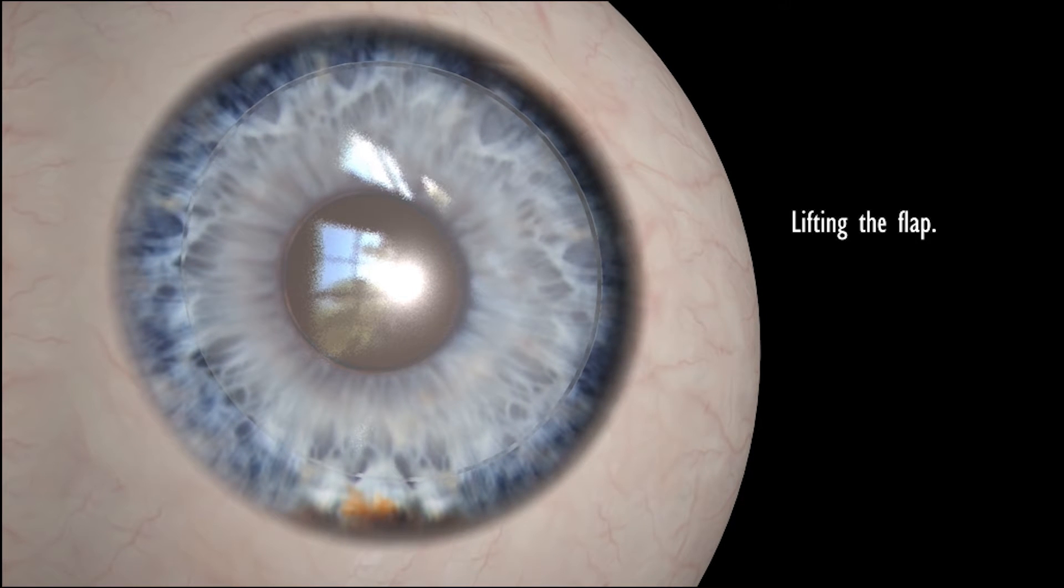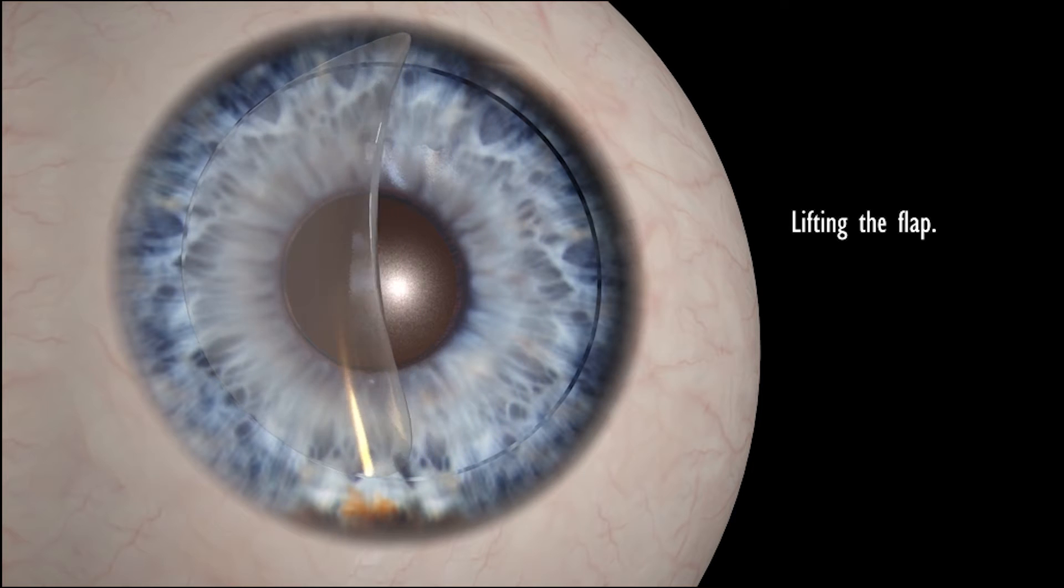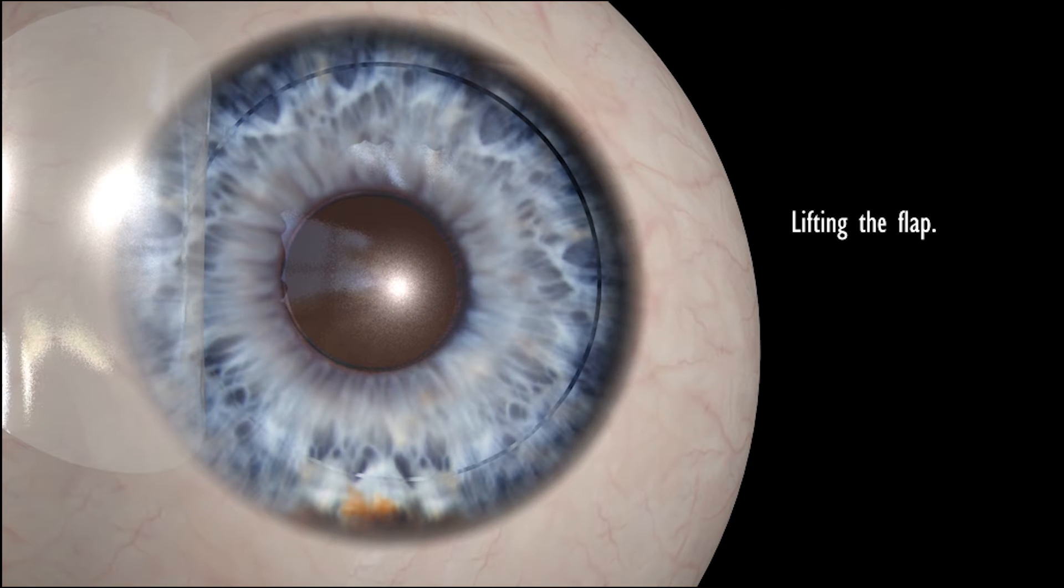Once the layers of the cornea are separated, the flap, remaining hinged on one side, is then lifted back, uncovering the stroma, or middle section of the cornea.